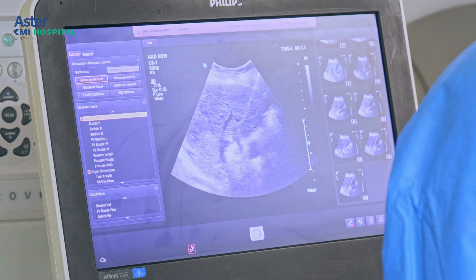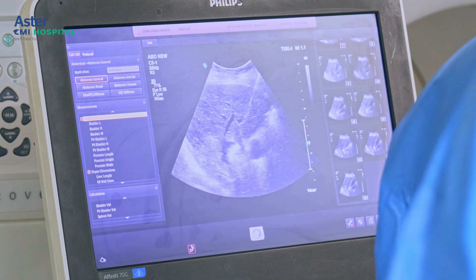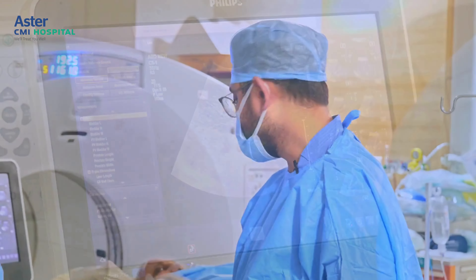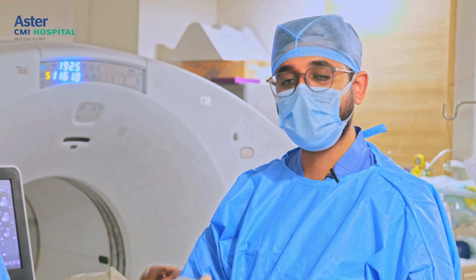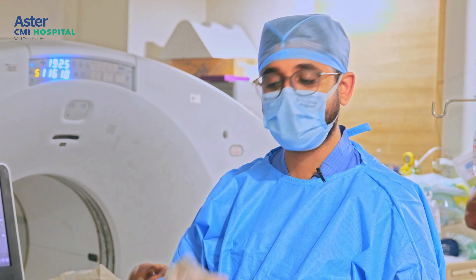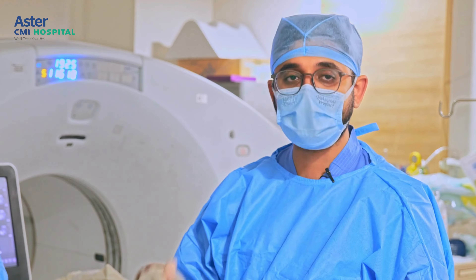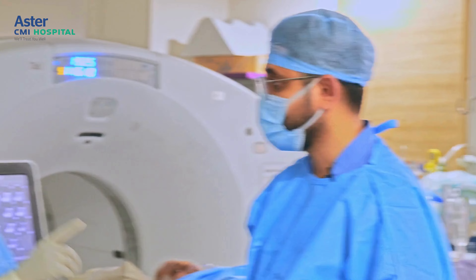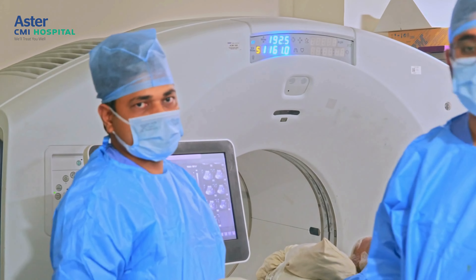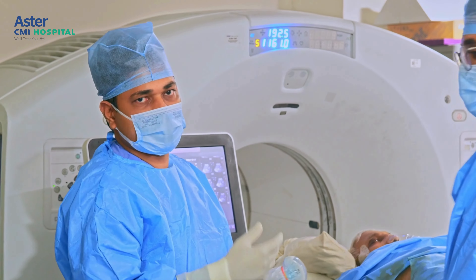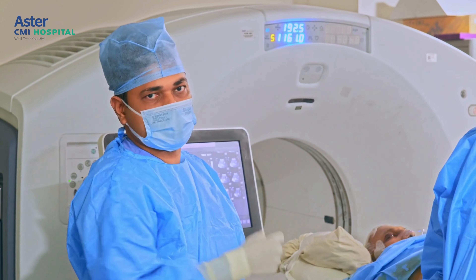We still have about one to one and a half minutes left. We will complete that and then take the needle out. The ablation is now complete. As we pull out the needle, we will perform what is known as tract ablation. This prevents tumour seedling — we make sure we are not carrying any tumour cells outside along the needle track. We ablate the entire tract as the needle is withdrawn. Tract ablation also stops bleeding — whatever bleeding comes from the tract is treated by tract ablation.